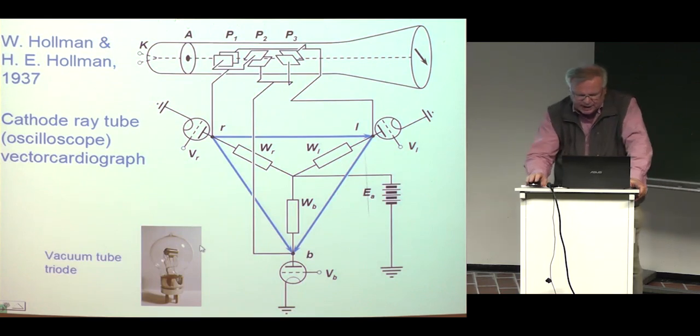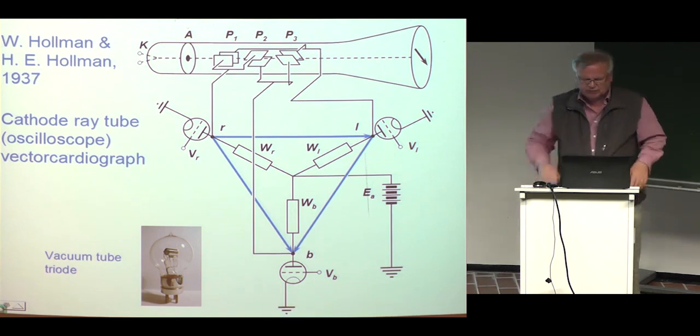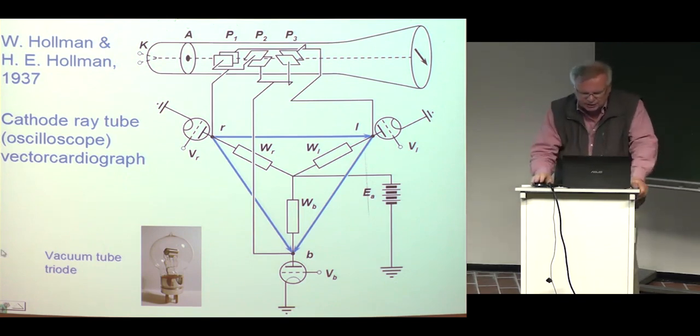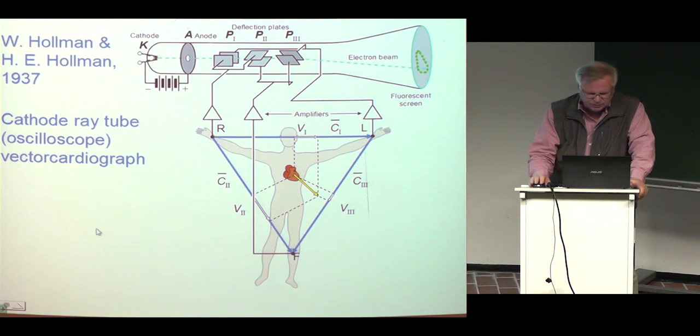Holman and Holman developed an oscilloscope tube which did not have the deflection plates in the horizontal and vertical direction, but just three pairs like the Einthoven leads, and signals were fed to these vacuum tube amplifiers here, here, and here, and the amplifiers amplify the signals to these deflection plates, and it formed to the oscilloscope screen the signal. So the vacuum tubes were used before transistors. I just show here an antique vacuum tube triode. And this is the same thing drawn in a bit different way. So that is a vectorcardiographic system.